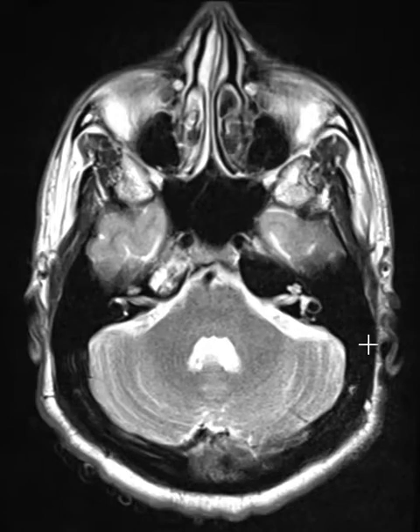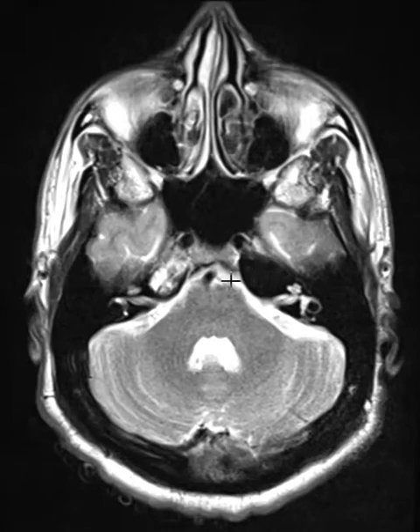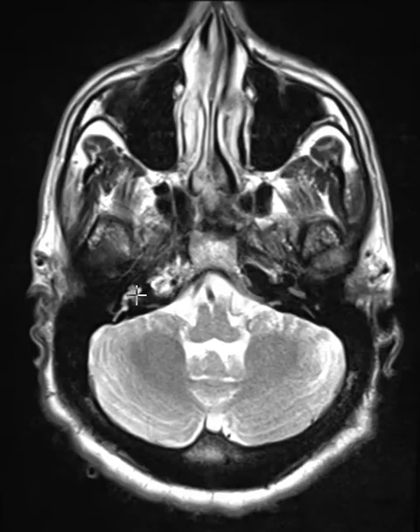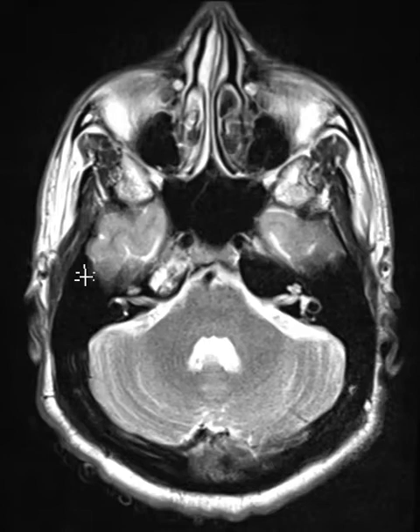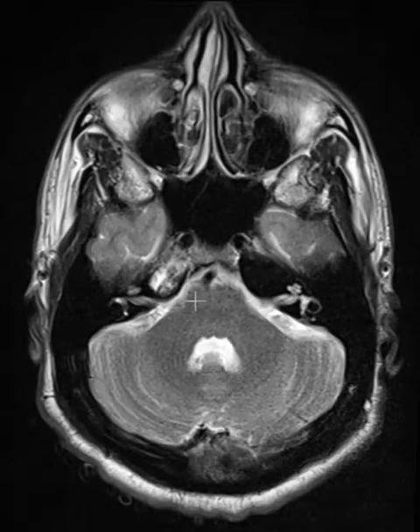This is called the petrous portion of the temporal bone, and this is called the mastoid portion of the temporal bone out here. The mastoid portion is almost always pneumatized, meaning it's filled with air cells. The petrous portion is sometimes filled with air, sometimes filled with marrow. When it's filled with air like here, this is a pneumatized petrous portion of the temporal bone. Now if we look on the opposite side, we see there is asymmetry.